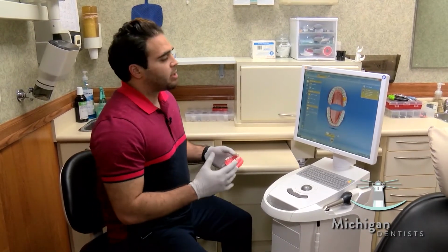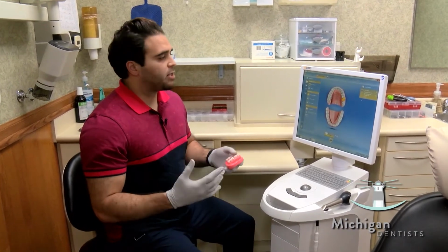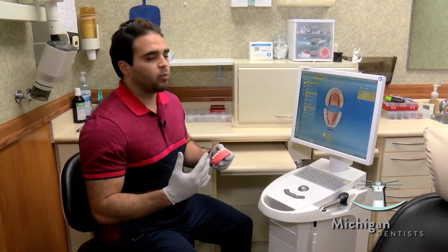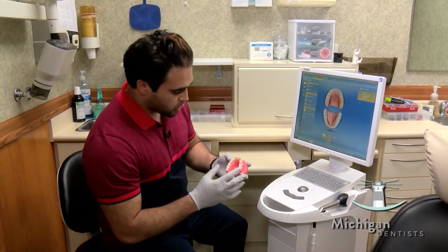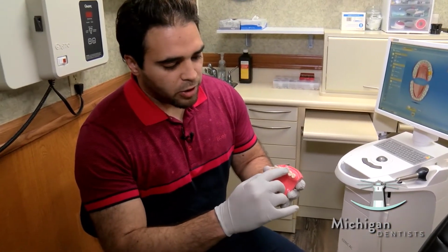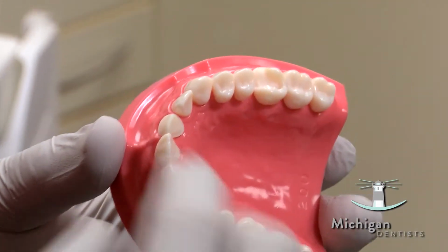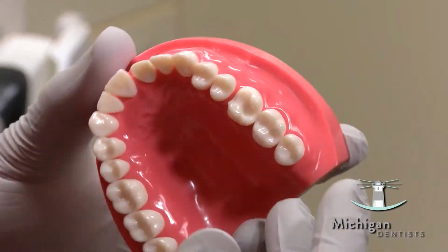So we're gonna simulate that this patient already came in with a broken tooth. I've already prepped the tooth for them. I've designed the restoration in my mind where I want it to be. So I'll show you, in regards to the prep, these are our margins. The restoration is gonna fit into that spot, essentially protecting the tooth, restoring it back to where it was.